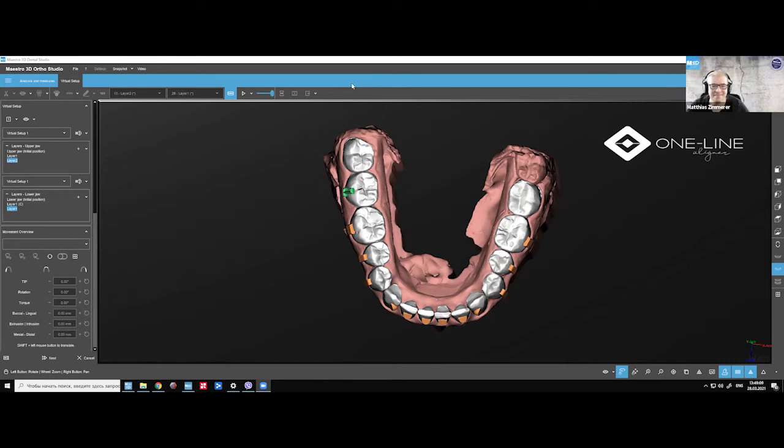So this is the Unis clear aligner light cure resin. What manufacturer would this be? This is Unis. Unis, who does the printer. Yeah, okay. This is a graphic one. Yeah. So this was sent to me just to see how it works out. So we'll be printing 2 or 3 aligners next week. So I can just post how it came out to see the results.